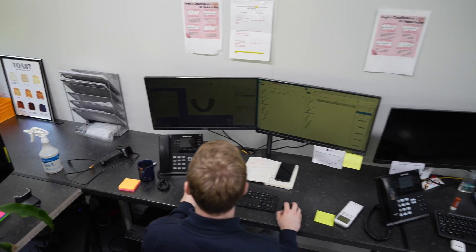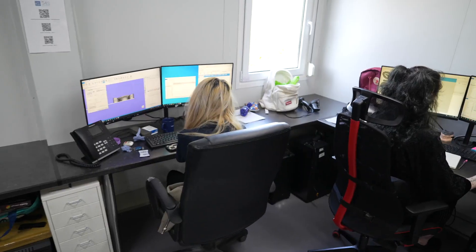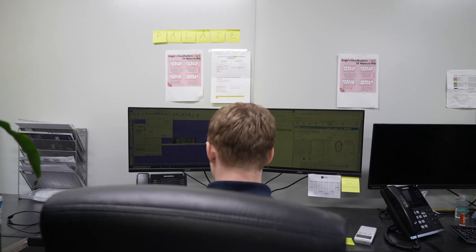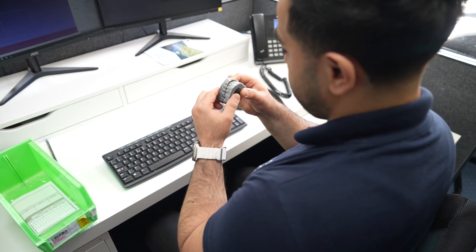We've covered the analog or traditional side of the business. This is the route our digital cases take — not everyone's fully aware of the work that has to go into a digital file to make it print. We have a team in here who solely prepare files for our 3D printers. That includes sometimes a little client education if they've got a brand new scanner and aren't quite sure how to get the most out of it, but typically we really have to get our models perfect to give the best quality product we can.